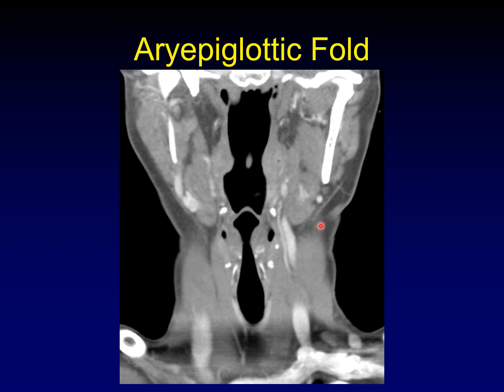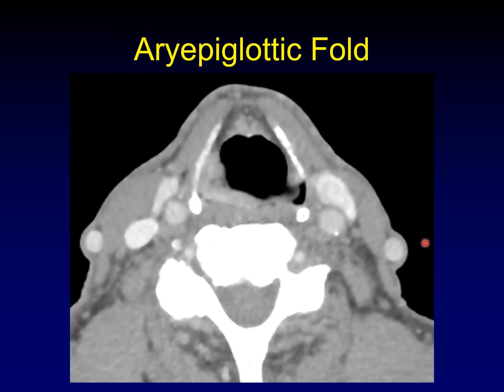The aryepiglottic folds drape over the sides of the epiglottis and extend down towards the arytenoid cartilages. They separate the larynx from the piriform sinus of the hypopharynx. So here's our epiglottis, and this tissue extending down on either side is the aryepiglottic fold, headed towards the arytenoid cartilages. Here's a tumor infiltrating into the aryepiglottic fold — you can see how thick it is on one side compared to the other, abnormally enhancing. The piriform sinus on the affected side has become compressed by the mass effect from the tumor.